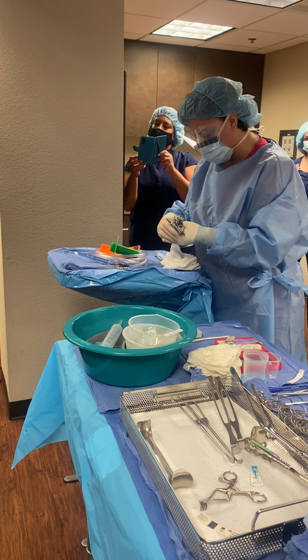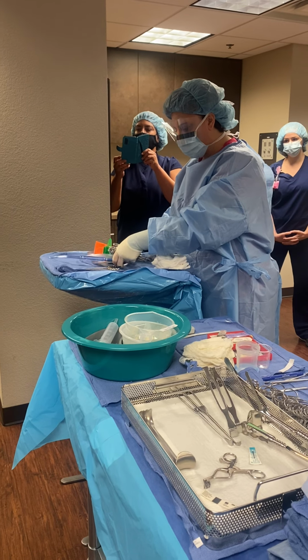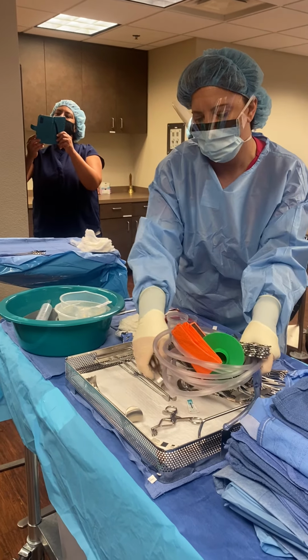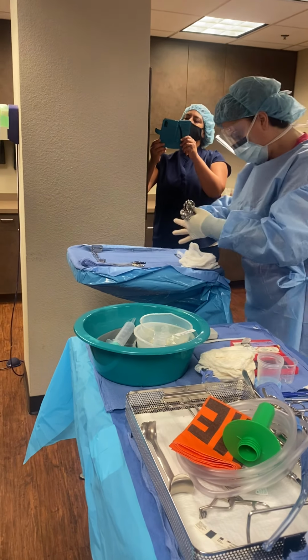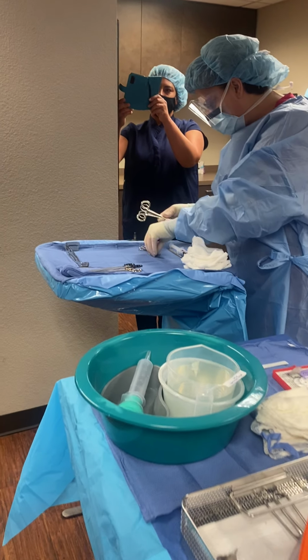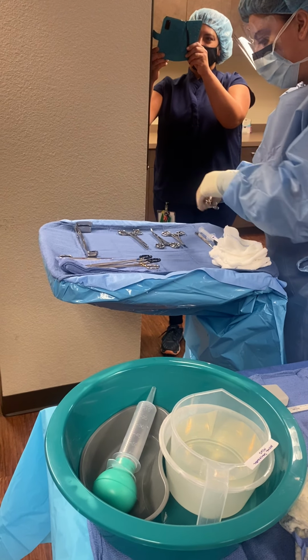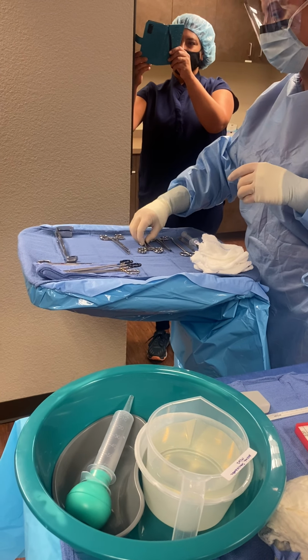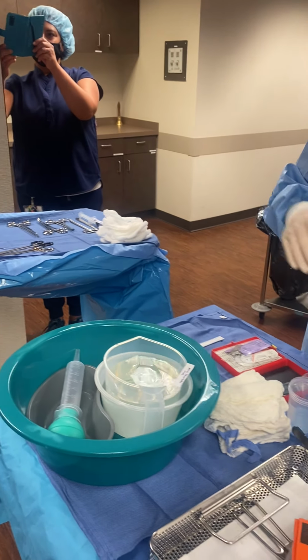I'll show you, but for now I'm just going to pair these things together. I'm going to move this for a second because he keeps getting in my way. Get my Army Navies while I'm over here. Okay, so I'll lay out the rest of my fun stuff. If we have a lot of instruments on the mayo stand, we want to use a roll towel, but for this there's not too many, so I'm just going to put them like that, like how you guys set up your mayo stand before.